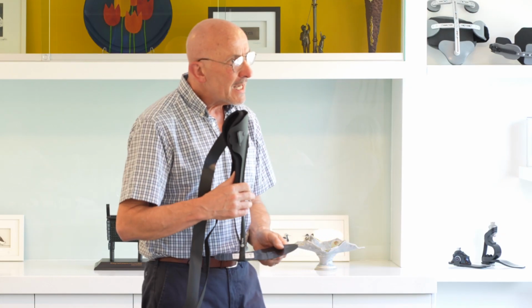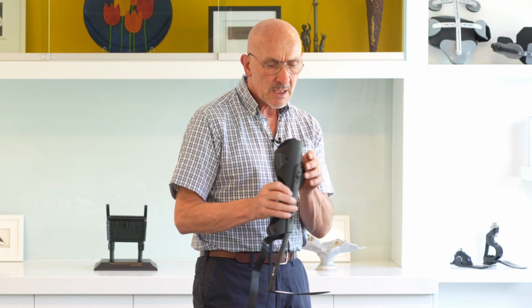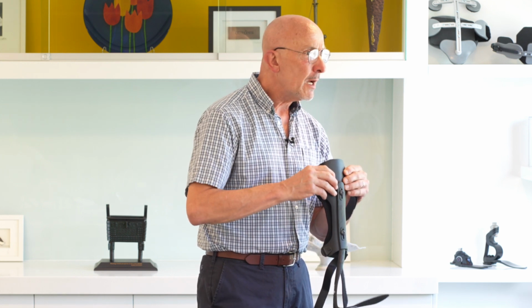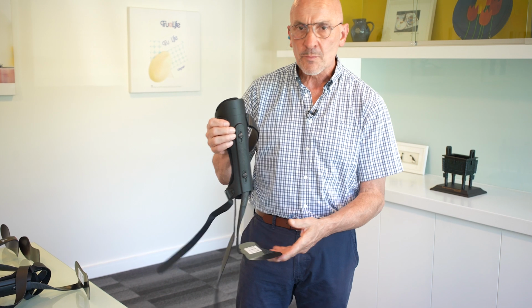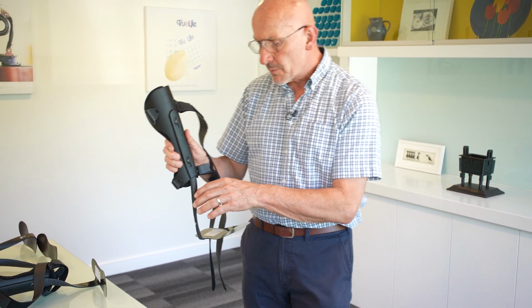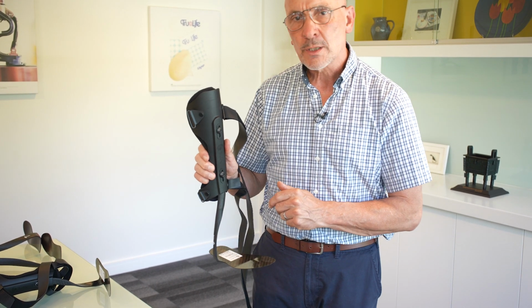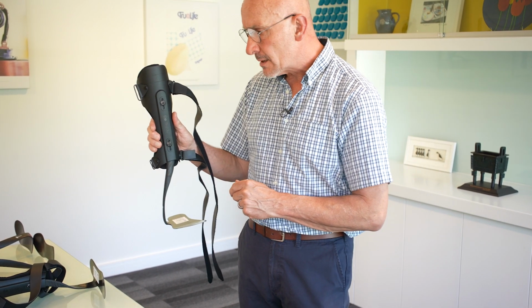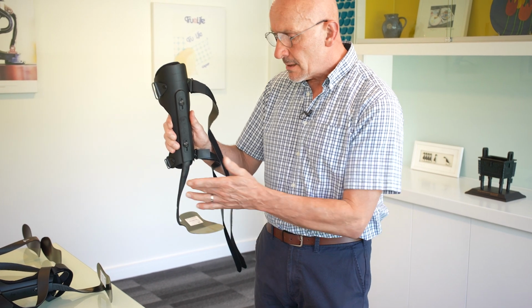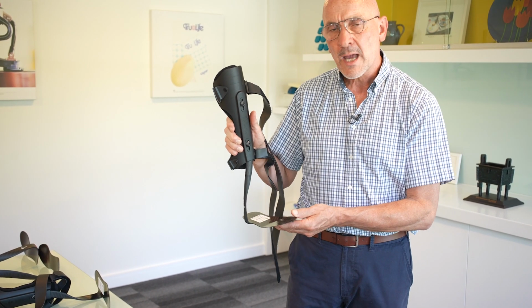The main advantage of this brace is that the design of it has an anterior strut over the shin, which is the reason for the malleable shell on the front. The plastic shell conforms readily to the patient's shin, but this has to be optimally adjusted to be just subpatellar on the patient.